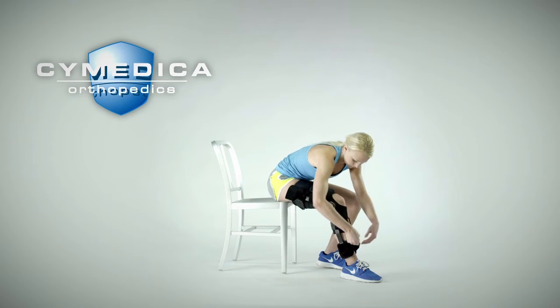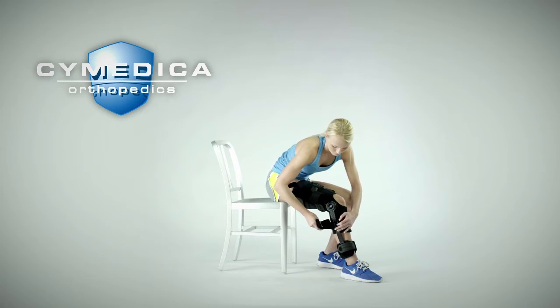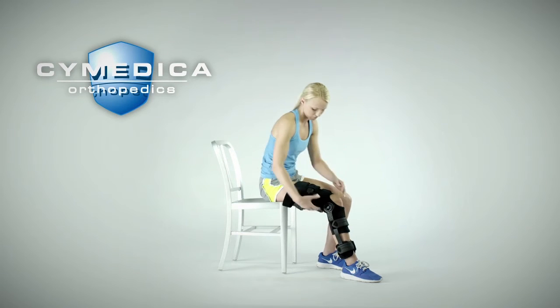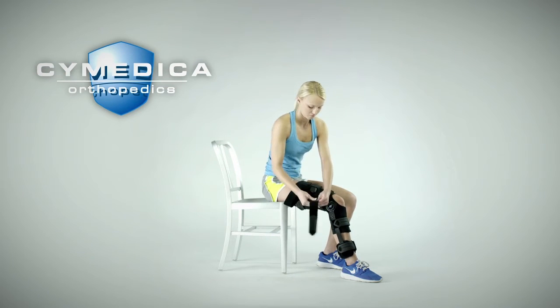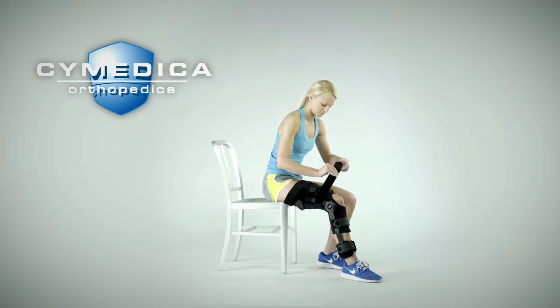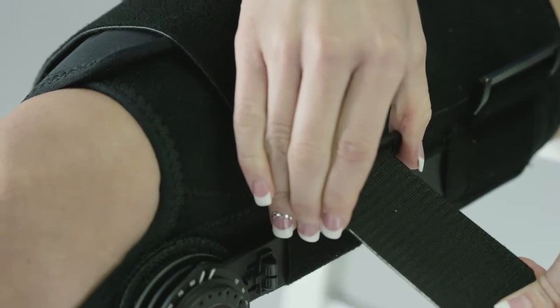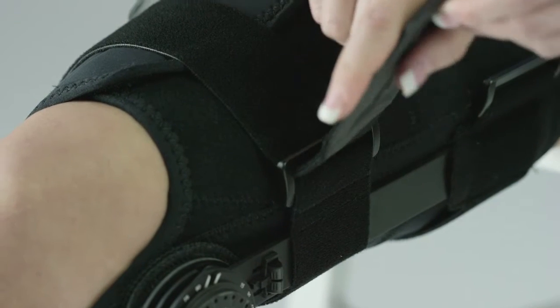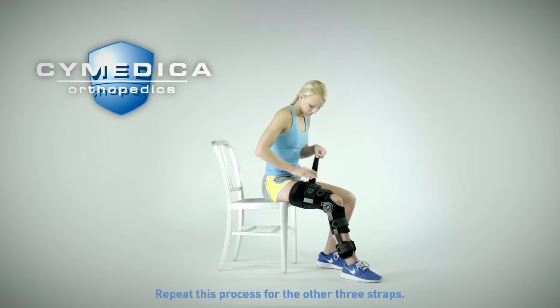Starting with the brace strap near the ankle, position the ankle pads midline on the leg on the inside and outside of the leg. Detach the strap connection on the outside and pull tight around the back of the leg and reattach the hook and loop connection. Pull the strap over the top of the leg through the plastic loop connection and then fold the strap end back on the strap to secure it. Make sure the strap is tight to minimize slippage of the brace. Repeat this process for the other three straps.